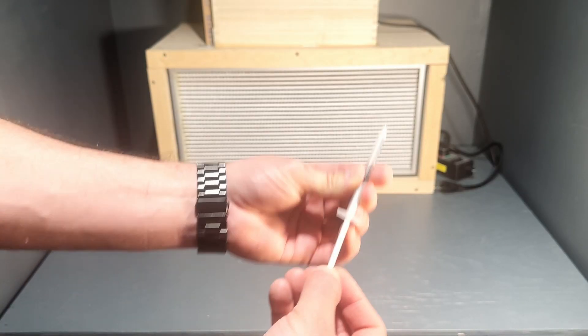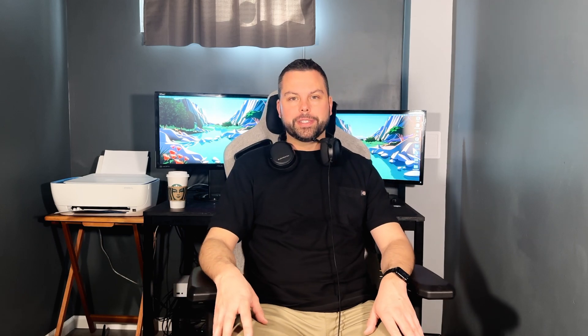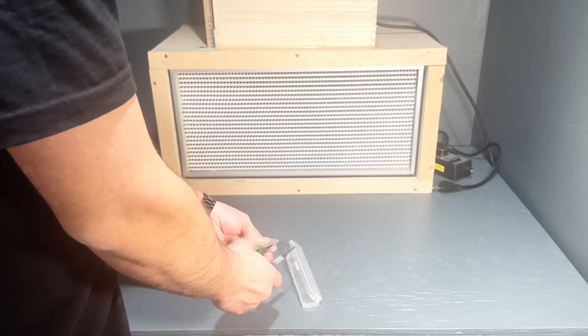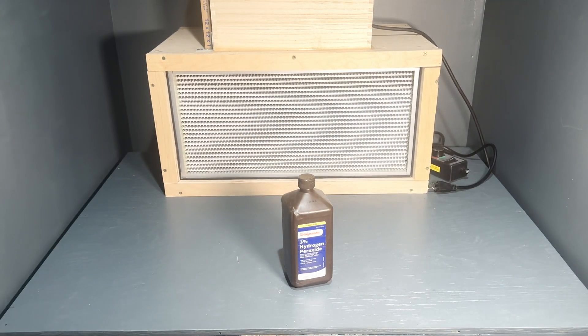Milliliter syringes — I recommend getting 10-milliliter syringes and also 1-milliliter syringes. Hand sanitizer, a scalpel and replacement blades, disinfecting wipes, a pH meter, ziplock freezer bags, hydrogen peroxide, and rubbing alcohol.